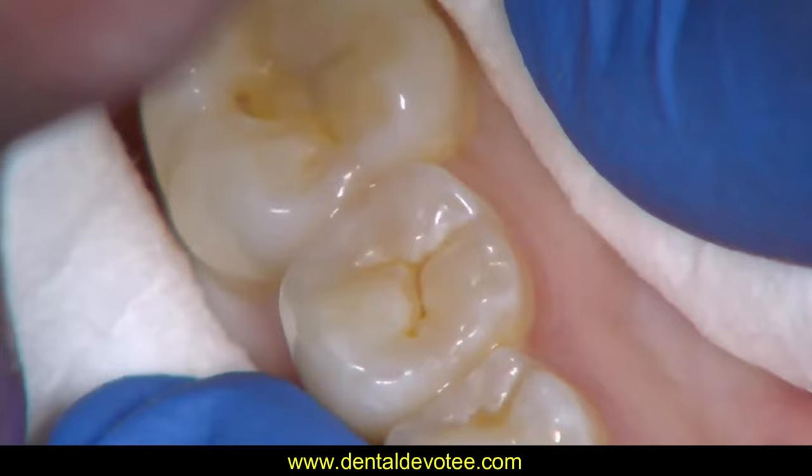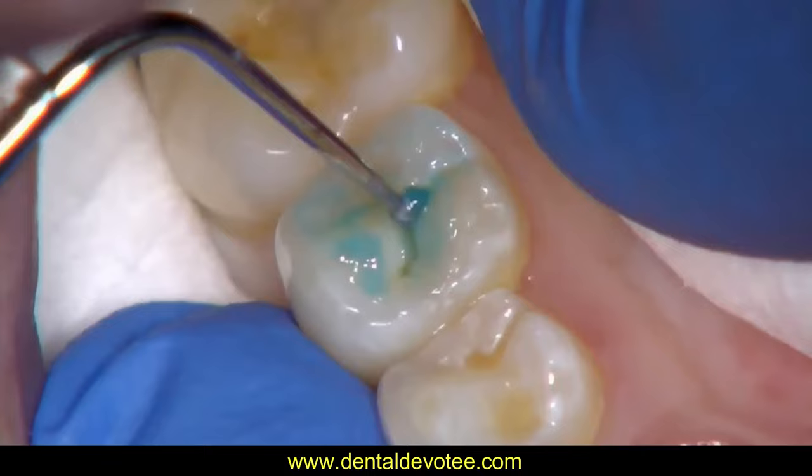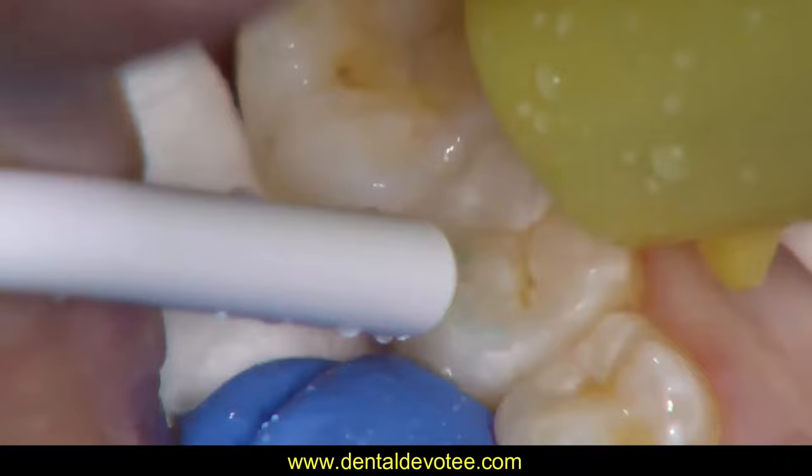Then the tooth surface should be etched with 37% phosphoric acid. Wash for 15 seconds, dry for 15 seconds.